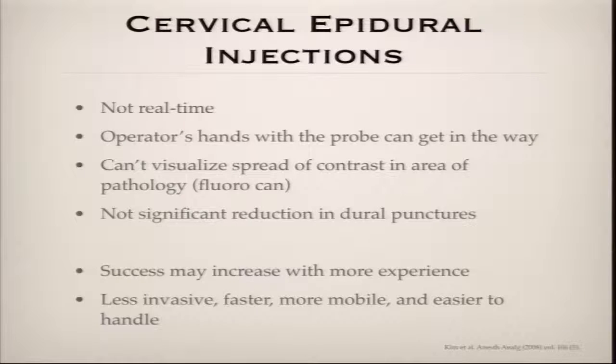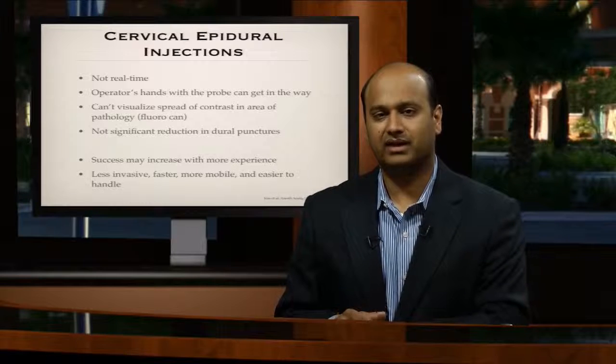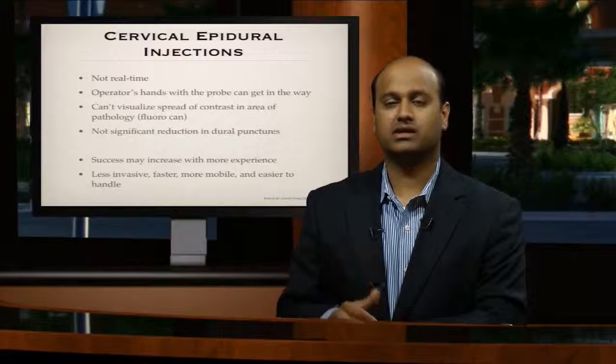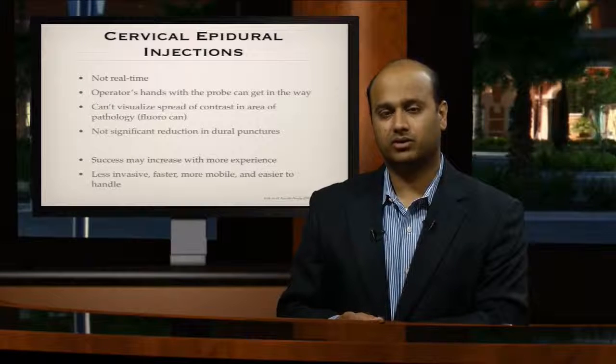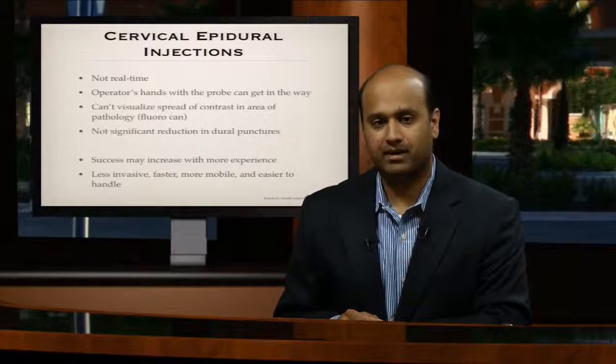So, what are the challenges with ultrasound for cervical epidural injections? Because of the limitations of operating the ultrasound and driving your needle at the same time, it's not very easy to do this in real time. So typically you're using the ultrasound to measure your anatomy and measure your angle, but you're not actually driving the needle under direct visualization, although there are some people attempting that currently.